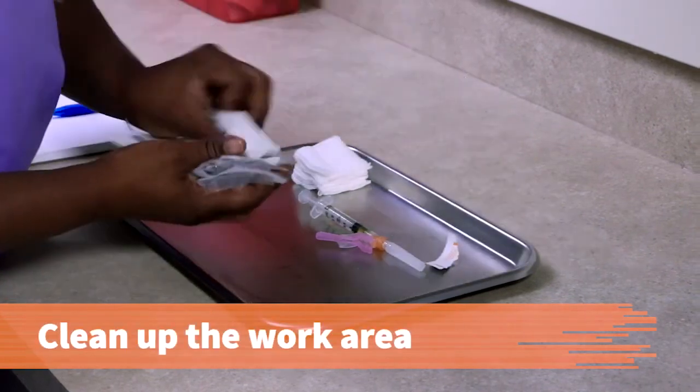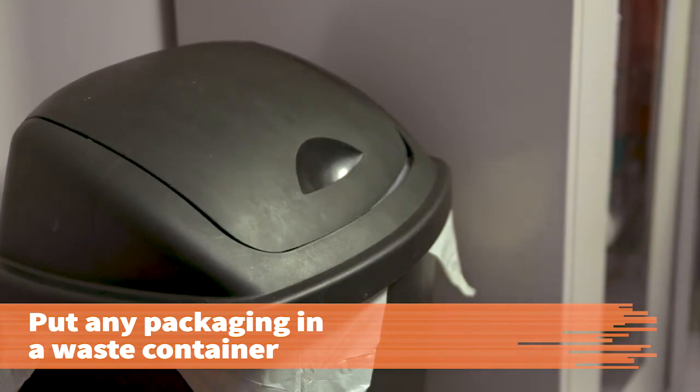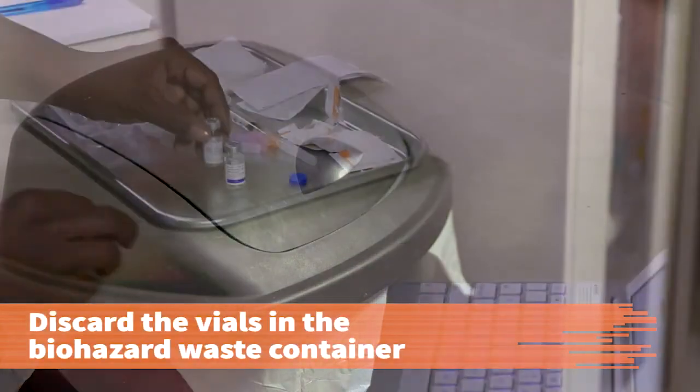Clean up the work area. Put the packaging and other waste in the waste container. Discard the vials in the biohazard waste container.